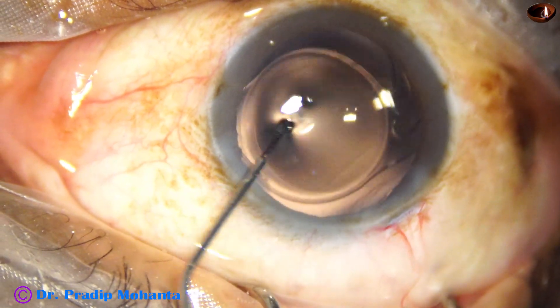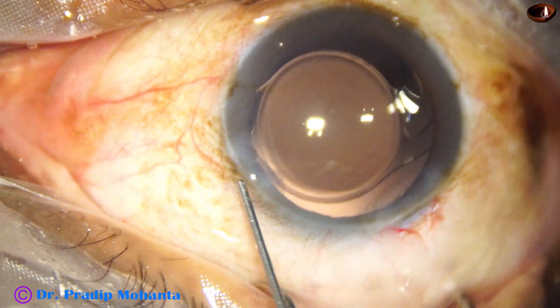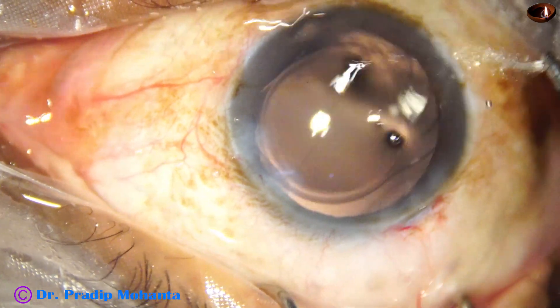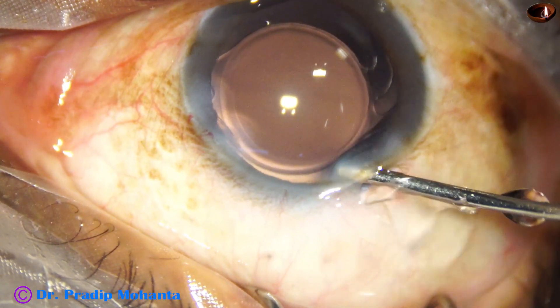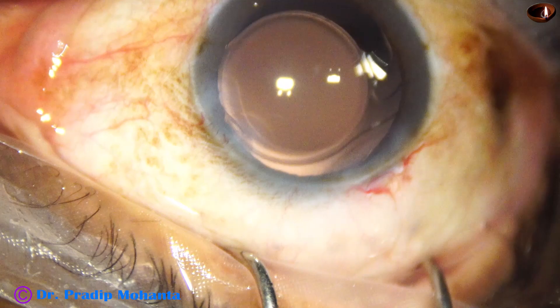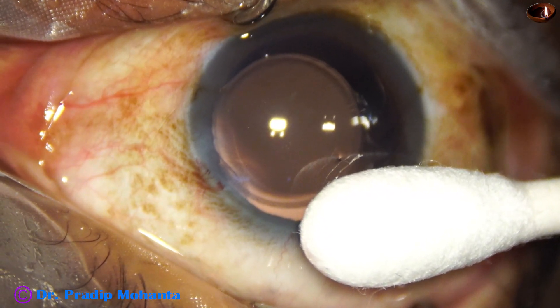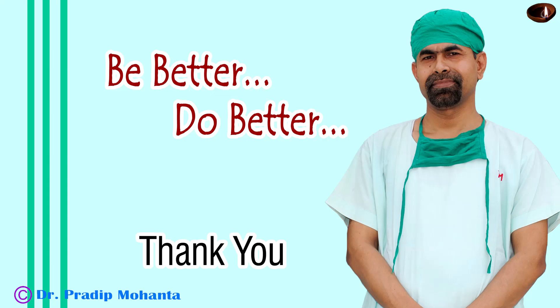This is a bit of Moxifloxacin. The side port is closed by corneal stromal hydration. The final lavage of the anterior chamber is done. In this case, I am not using SIMCO — this is an irrigation probe. Formation is done using the side port. Check the wound — no leakage. Once the wounds are checked and there is no leakage, a few drops of Moxifloxacin are applied and the case is concluded.